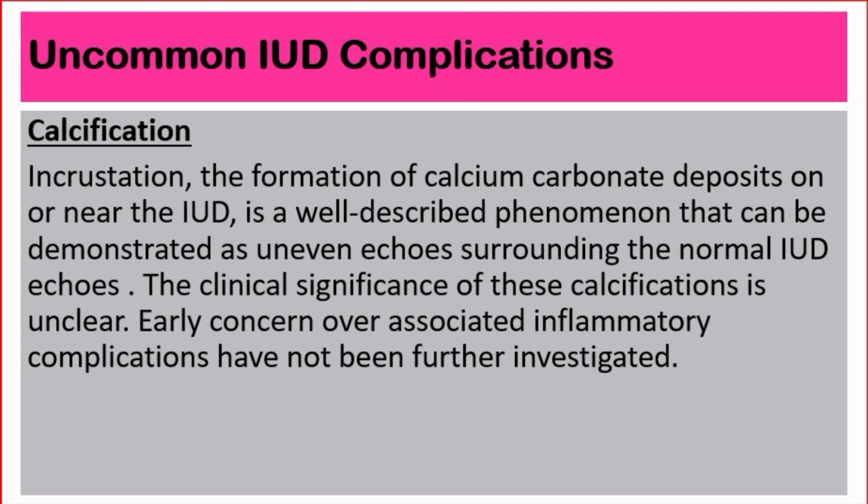Number 2. Calcification. Incrustation, the formation of calcium carbonate deposits on or near the IUD, is a well-described phenomenon that can be demonstrated as uneven echoes surrounding the normal IUD echoes. The clinical significance of these calcifications is unclear. Early concern over associated inflammatory complications hasn't been further investigated.